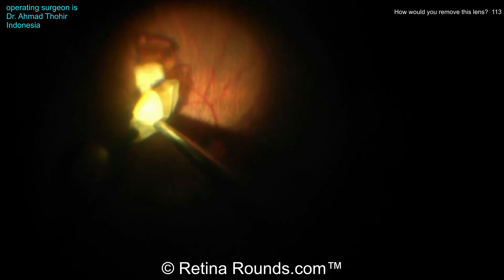The downside of using that material is that lens fragments can get stuck in the viscoelastic, or if PFCL is used, lens material can get lodged in the interface between the PFCL and the retina. So there are definitely downsides to using something to protect the macula. In this case, Dr. Tohir has opted just to remove the lens material without anything over the macula using the fragmentation probe. There is a little difficulty because this lens material is quite dense — the lens keeps falling back to the posterior pole and doesn't appear to be folding into the frag probe very nicely. In some cases, the lens material is almost being repelled away from the fragmentation probe, almost like a jackhammering effect.